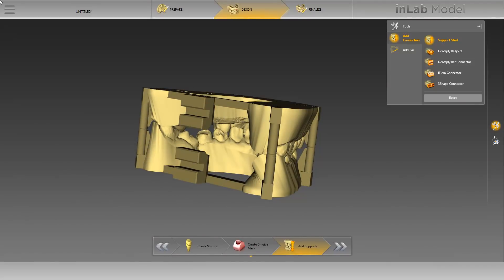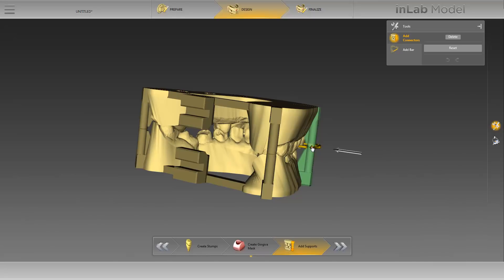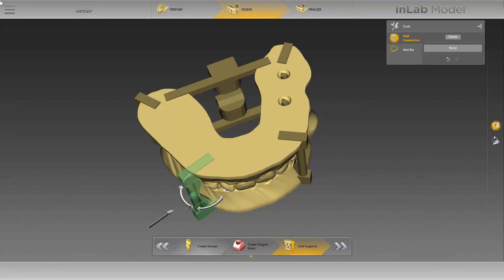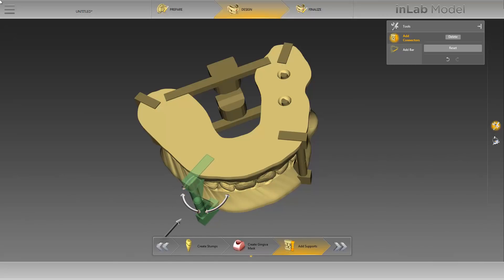At this point, the support struts can still be adjusted. By single clicking on one of the struts, it is activated and will be highlighted in green. Additionally, various directional arrows will appear. As soon as you move the cursor over a directional arrow, it will be highlighted in yellow and the strut can be adjusted by holding down the left mouse button and moving the mouse. Using the displayed circular arrow, you can rotate the strut around its own axis. In the same way, you can also make changes to all elements placed on the model in this step. We will end the design phase here and move to the last phase, the finalize phase, by clicking on the double arrow.